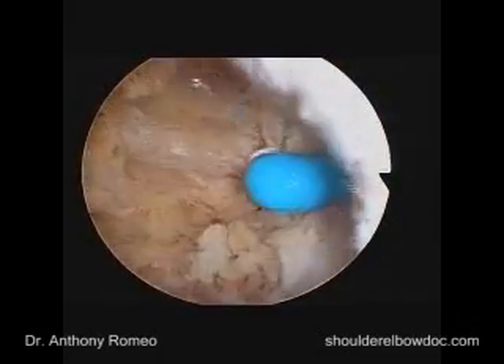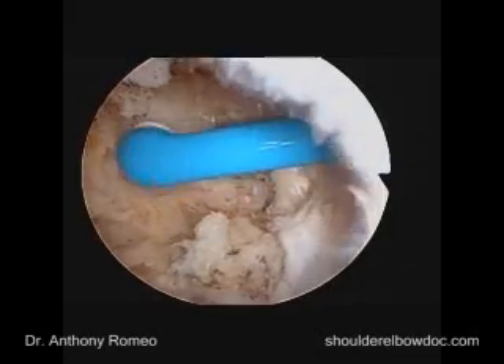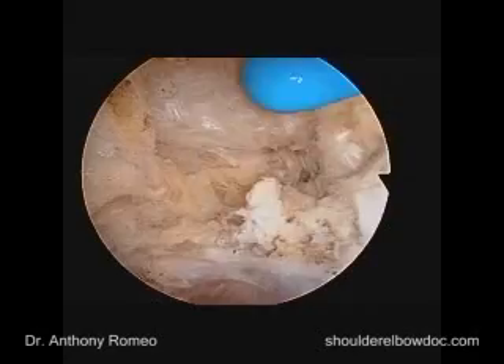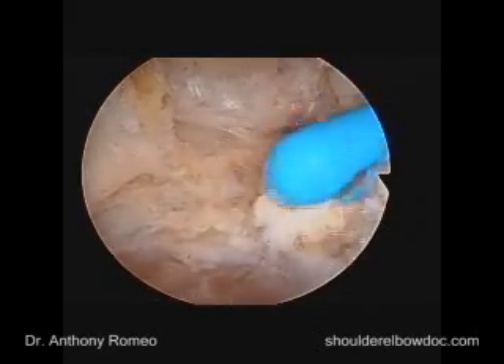If we needed to do a coracoidplasty, what we'd oftentimes see is this prominence coming towards us. We would then take a shaver and a burr and flatten that out so it looks exactly like this patient has at this time.